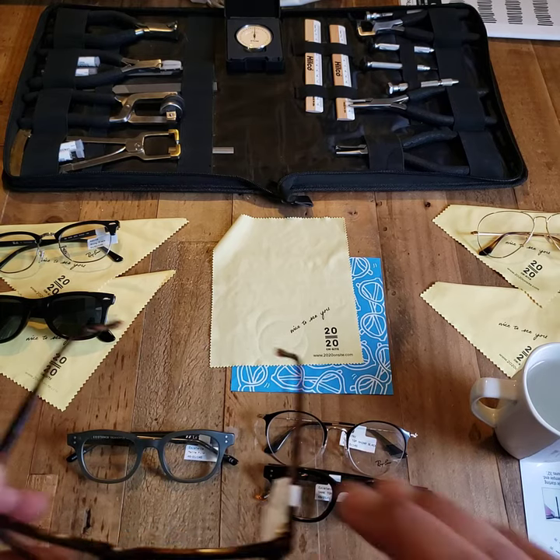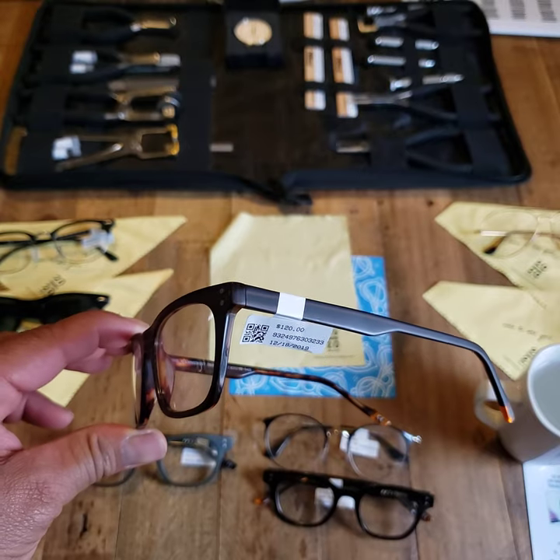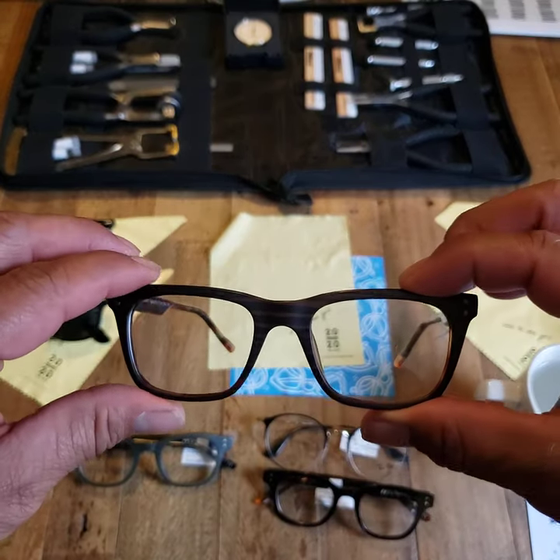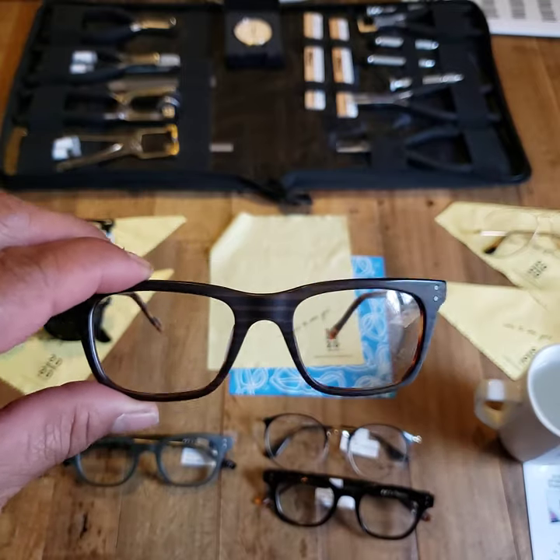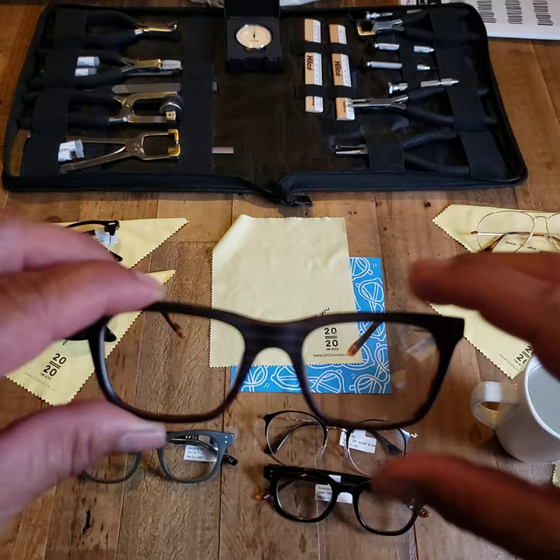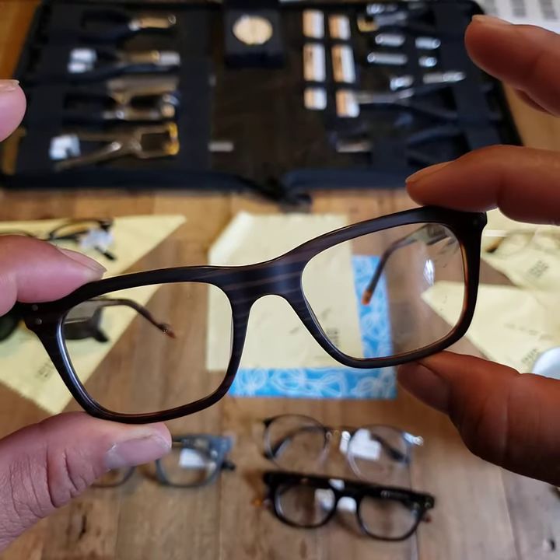Hey team, Ivan here. Wanted to reach out about crooked glasses. Never wear your glasses and they seem a bit crooked — maybe you slept in them or just wore them over time. You happen to look in the mirror and they seem like they're a bit off, one side higher than the other.